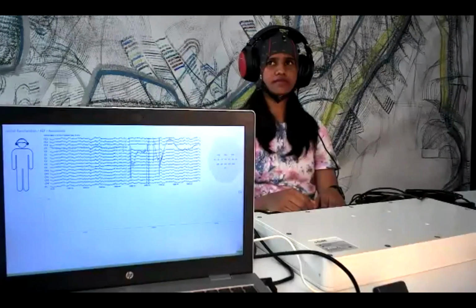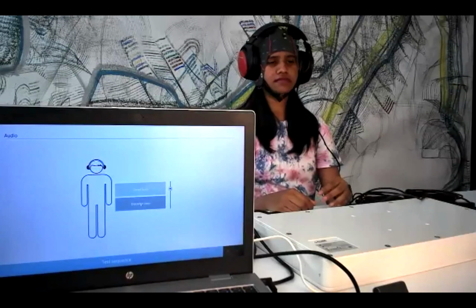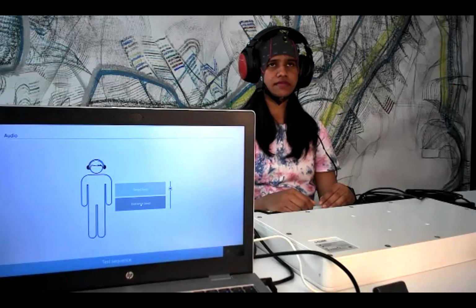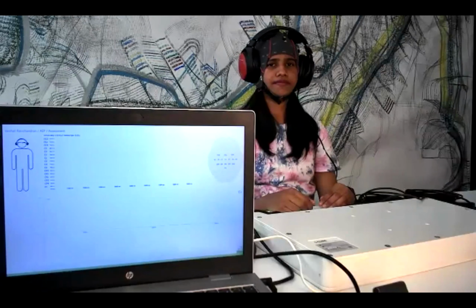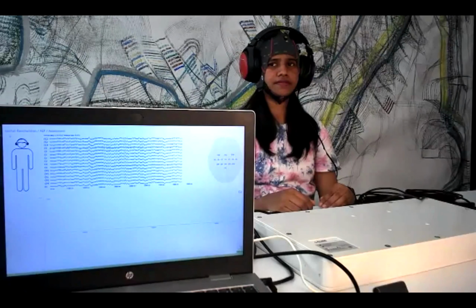Okay, so as I explained a little bit before, we have two tones, the high tone and the low tone. So can you hear? Great. So if you're ready, then we can start. Okay, so just count the number of the high tones while ignoring the low tones. Okay, ready? Let's go.